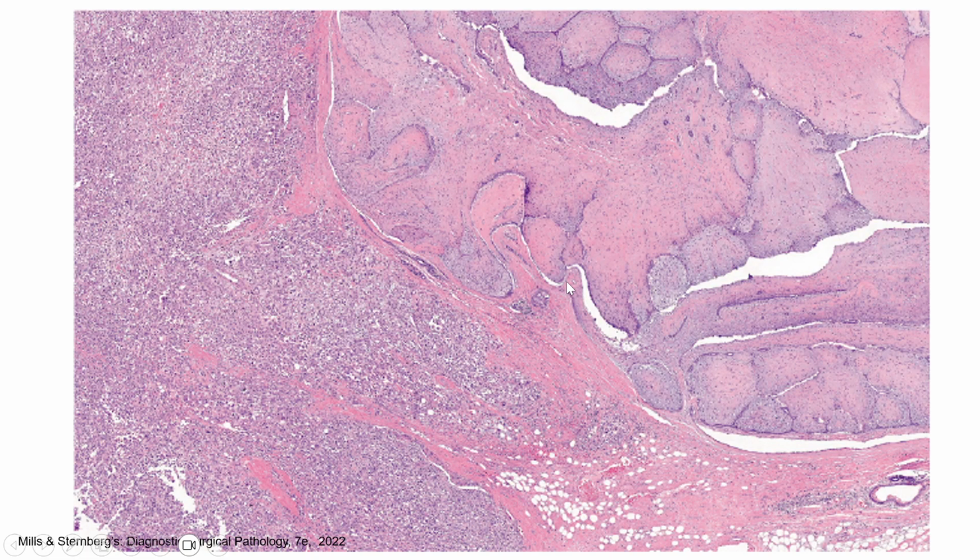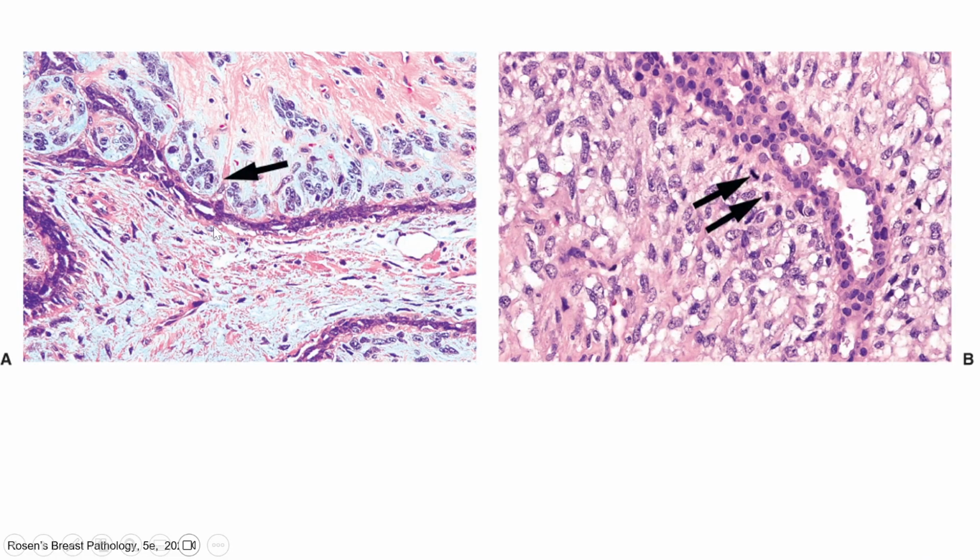But the microscopic feature is clearly malignant because we can see conventional benign phyllodes tumor on the right side, and then we can see these sarcoma changes, malignant heterologous component, really high grade sarcoma atypical cells. We can see close to the epithelial component in this malignant phyllodes, we can see these atypical cells, and then also tons of mitosis. The cells also show atypia.